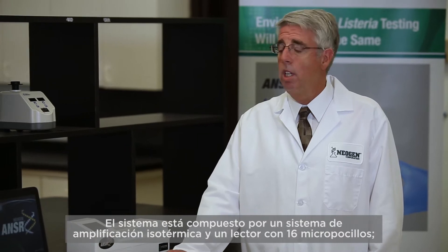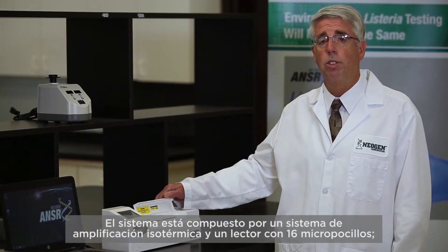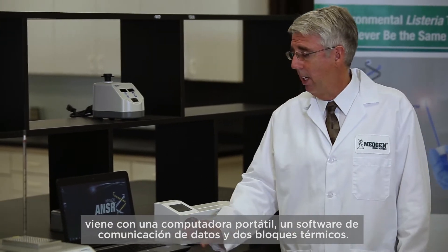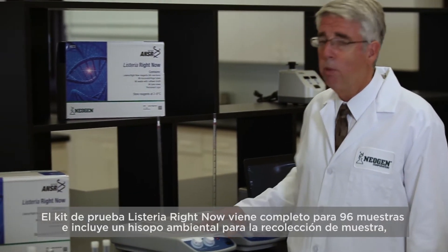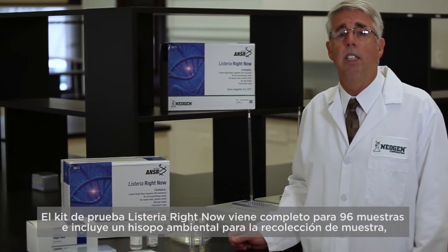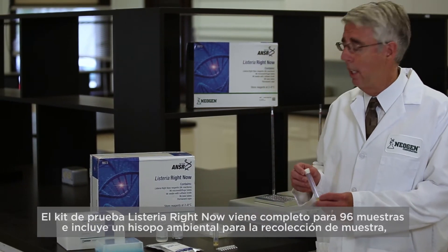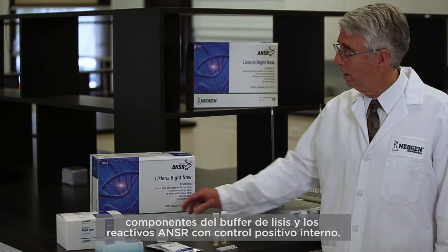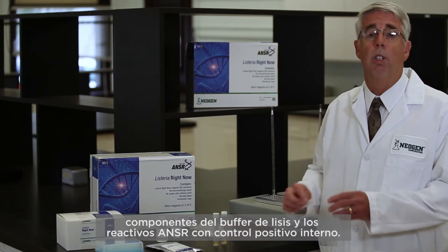The system is composed of an isothermal amplification system and reader with 16 wells. It comes with a laptop computer and data reporting software and two heat blocks. The Listeria Right Now kit comes complete for 96 samples and includes an environmental swab for sample collection, the lysis buffer components, and the answer reagents with an internal positive control.